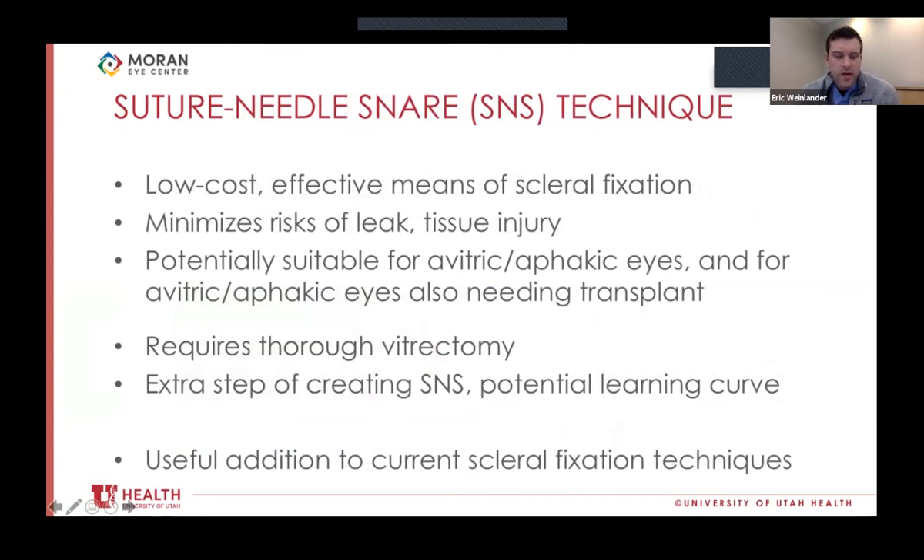In summary, we feel that our variation on the snare technique — the suture needle snare — is a good, low-cost, effective means of scleral fixation that minimizes surgical risk factors for sclerotomy leak, tissue injury, and uveal injury. It is particularly helpful in avitric, aphakic eyes, especially in patients who need to be open sky during the procedure. Downsides: it does require thorough vitrectomy, as passing open suture loops through the eye if you snare vitreous is a recipe for disaster. Creating the suture needle snare has a learning curve, and introducing multiple suture loops can be a stumbling block. But we feel this technique is a useful addition to current scleral suturing methods.